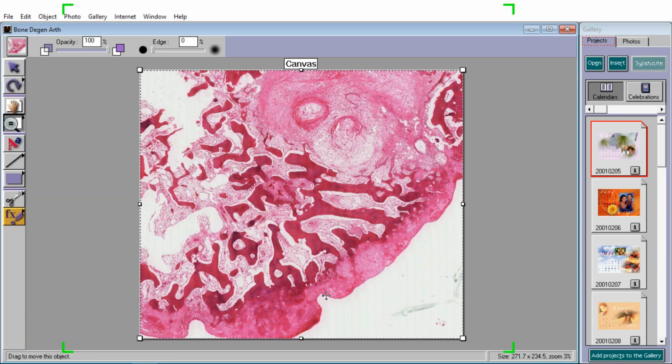It's also called osteoarthritis, but I think I like the word degenerative better, and degenerative is probably used more commonly now by radiologists and pathologists and rheumatologists because it is truly a degeneration or a loss or an erosion in number of cells. And of course, if you were a radiologist looking at this in a real patient's knee or elbow or something, you would see a thinning of the joint space because now there is thinning of the cartilage, and it might look like bone was almost connecting directly with bone. How do you like that?